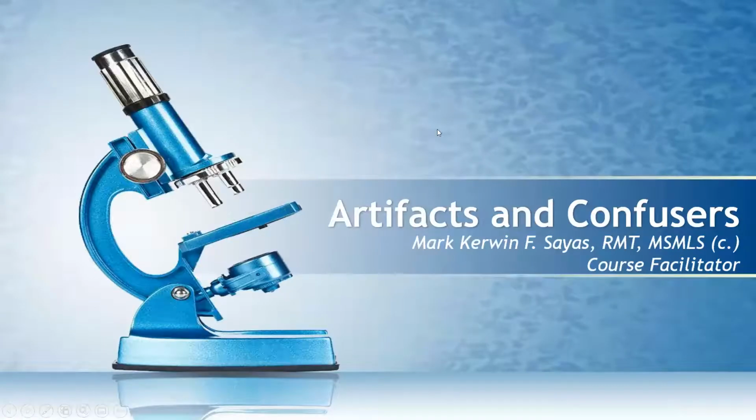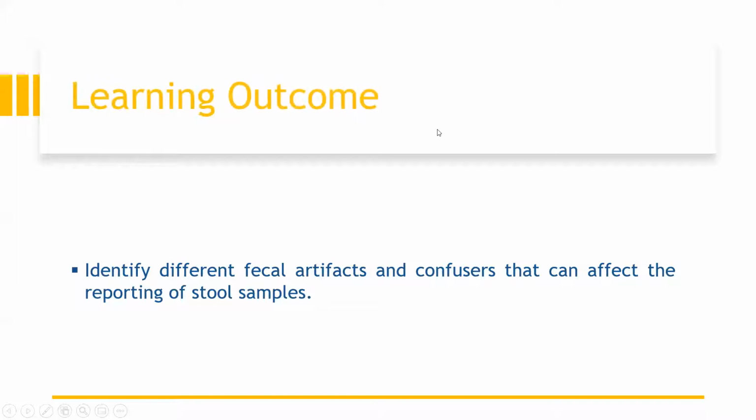Hello, future RMTs. Welcome to the discussion of artifacts and confusers in clinical parasitology. Our learning outcome is to identify the fecal artifacts and confusers that may affect the reporting of stool samples.